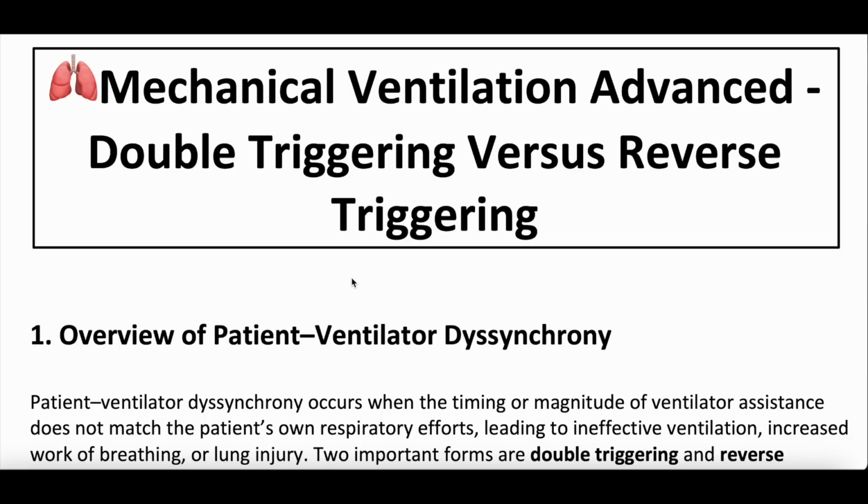So this is part of our mechanical ventilation advanced series on ventilator desynchrony. And we're going to dive into these two different types of ventilator desynchrony. They can be very tricky to tease out which is which, but we're going to give you some ways in which you can do it. And once you do, the management of them is quite different, which is why it's so important.